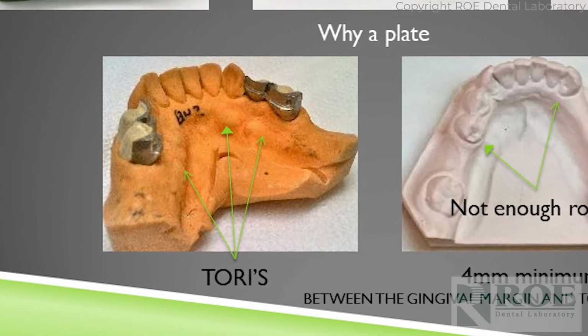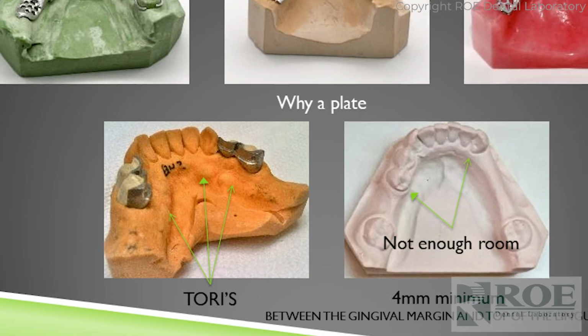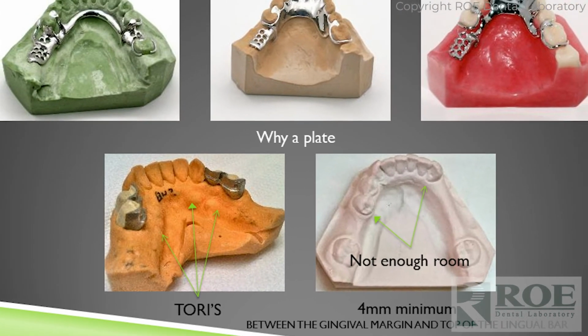Tooth extraction. Okay. So Ahmad, regarding major connectors, often we have requests for or we design cases with anterior posterior straps on a maxillary case. Why would we do that? What are the advantages for the doctor to do that? The advantage for the doctor, two things. First, sometimes the patient has tori, growing bone in the middle of the palate. So it allows us to go around it, open it so the patient doesn't press on it by the metal.